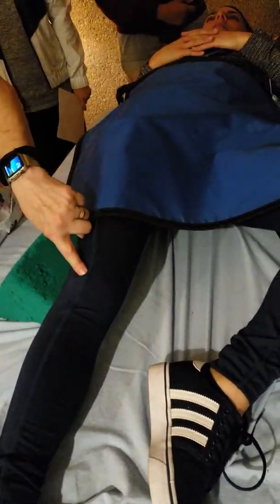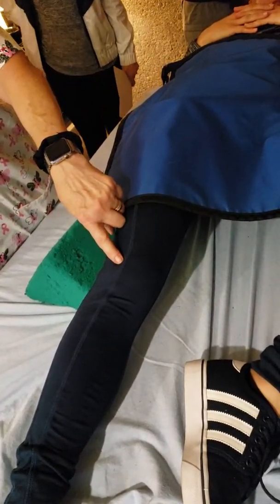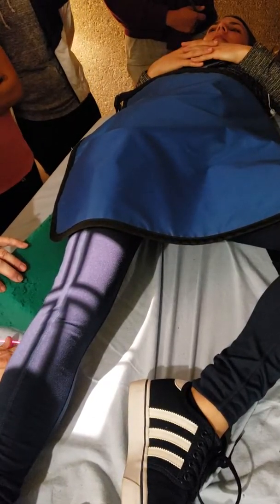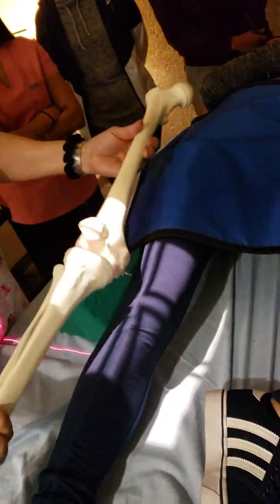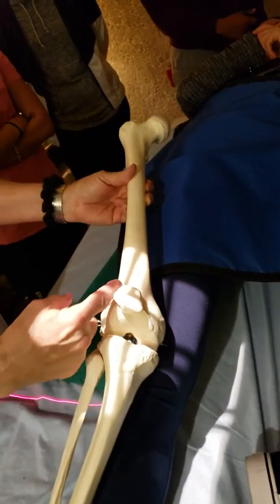Medial condyle. Right? So it's right there. So now we're centering just to the lateral side of the patella. My marker's still going to go right here — probably right about in the middle. So this is what it's going to look like. The patella is just over the medial condyle, and so the central ray is just to the lateral side of the patella.